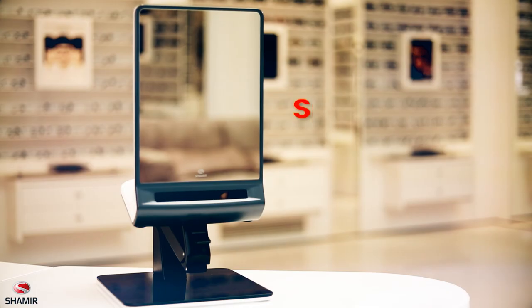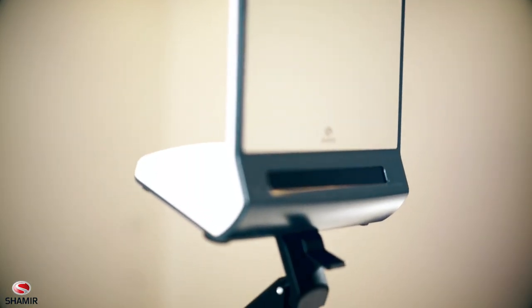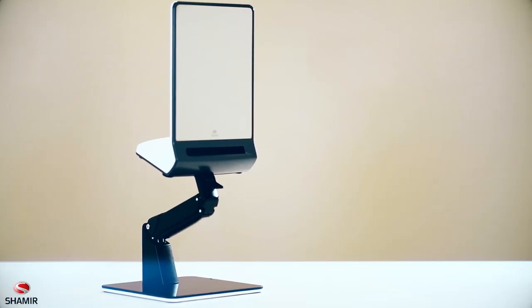Shamir is proud to present SparkMeUp, a revolutionary new measuring device that gives your clients a comfortable high-tech experience while saving you time and guaranteeing measurement accuracy.